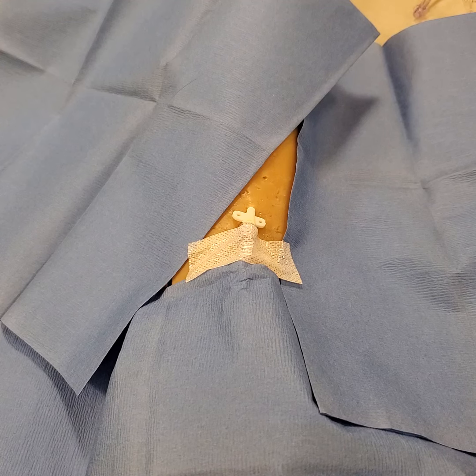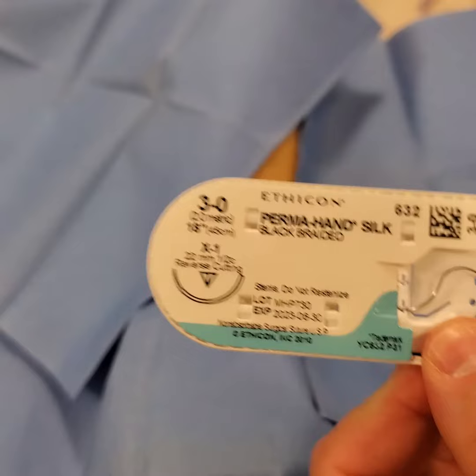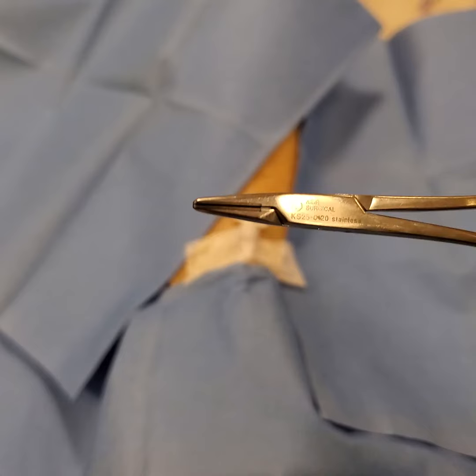Suturing a standard flanged indwelling catheter. We have a standard catheter with flanges attached and we'll go over how to suture it. We're going to be using some 3-0 silk and some straight needle drivers.